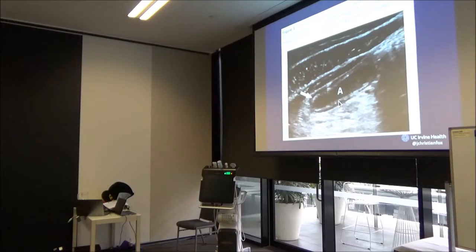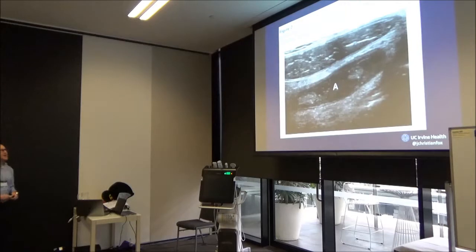There's a big trend now towards giving antibiotics. So if you see a really nice submucosal layer there, a very hyperechoic inner wall, maybe that's a patient that, depending on where you work and the situation you're in and your surgeons and all these factors, might get IV antibiotics and get watched for 12 or 24 hours and maybe avoid a trip to the theater. Okay? How about this one here?